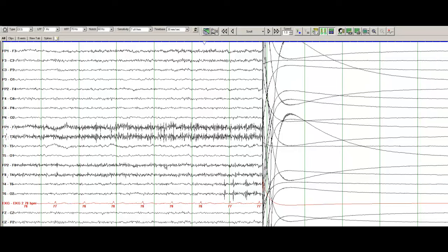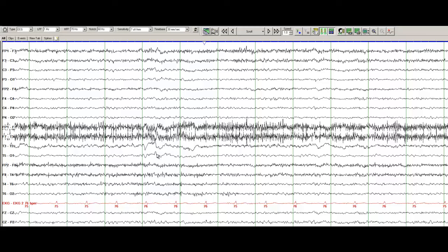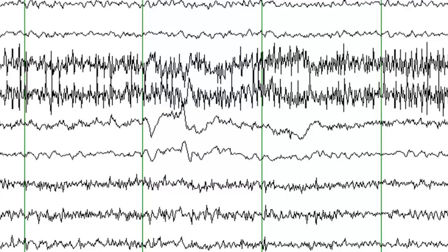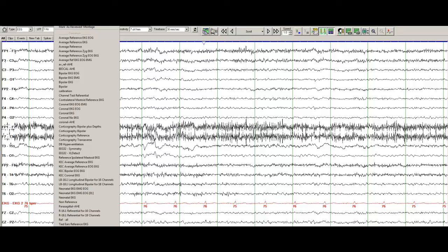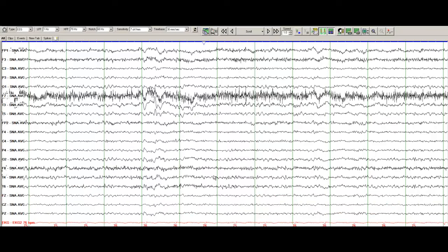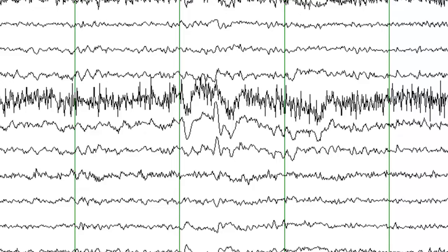Moving on a little further, with the slowing we also see a little sharp component here. The montage — which is how the electrodes are arranged in relationship to each other — where input two of the first channel becomes input one of the second channel is typically referred to as a bipolar montage. On bipolar montage, you are seeing a tiny sharp wave at T3, T5, and T5-O1. To better resolve it, I am going to change the montage to an average reference montage. The sharp waves become a little more prominent at T3 and T5 when we change that montage.